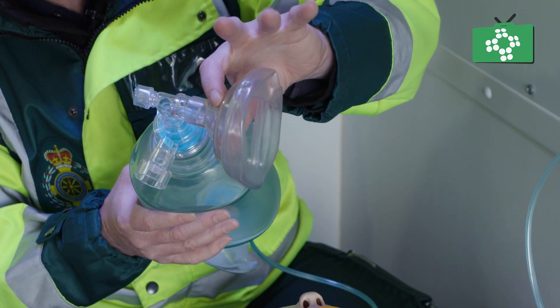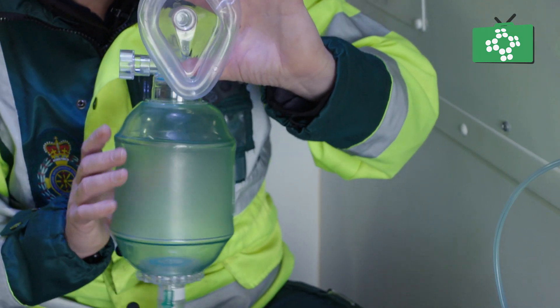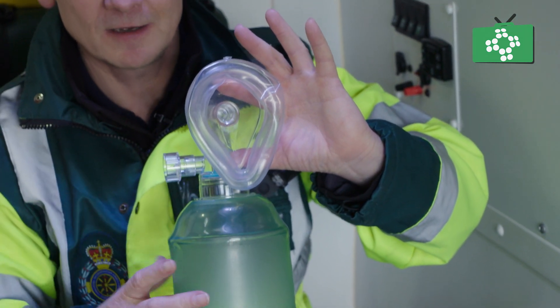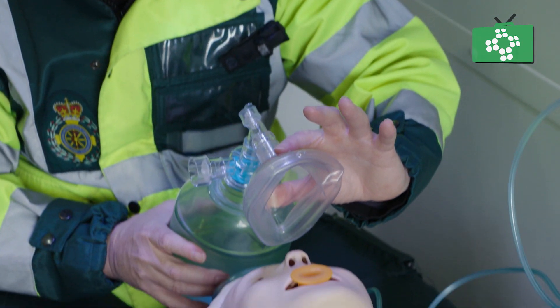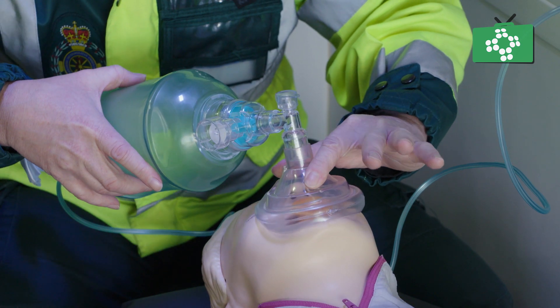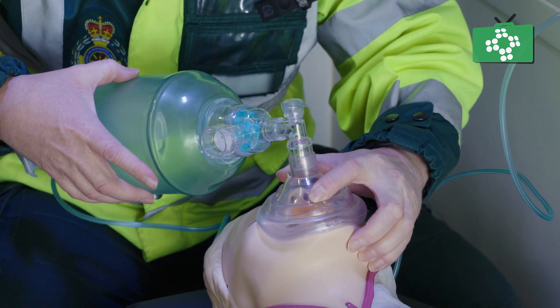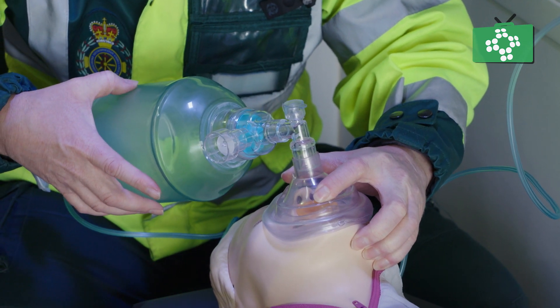keeping these three fingers free. Then the pointy part of the mask goes over the bridge of the nose, and then roll the mask down onto the patient's face, securing it with those three fingers over the hard bone of the mandible.